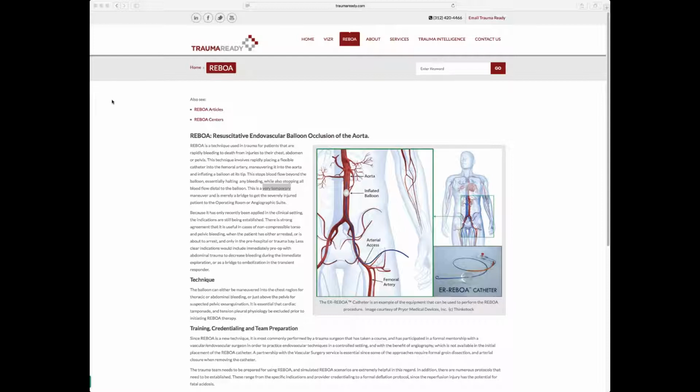Is it a new device, or is it just an old device that's very seldom used? I've never seen it. You know, Travis, it's either an old device that I just haven't seen, or it's a new device. I think it's fairly new or somewhat new, but I've just never seen it. Because we see so much trauma, I assume it's relatively new. But so there was that.